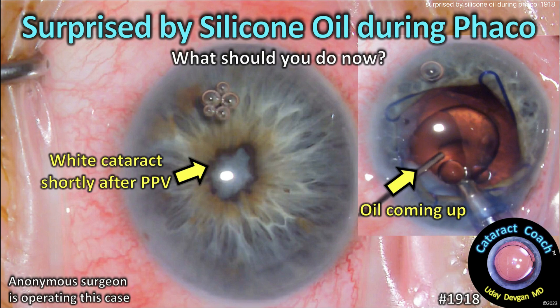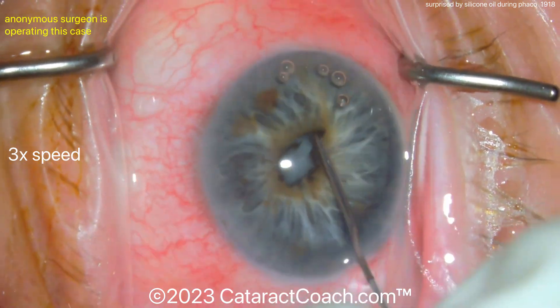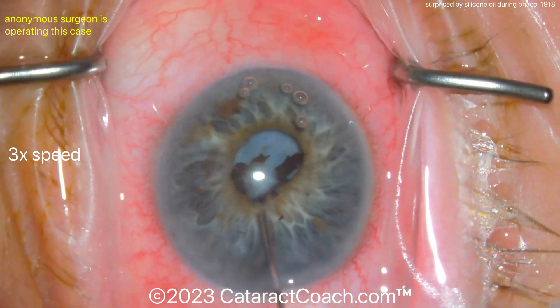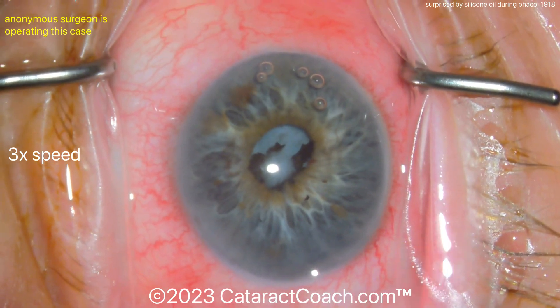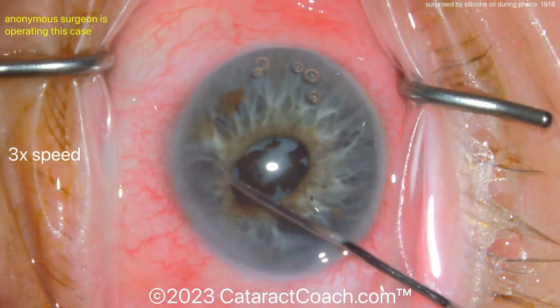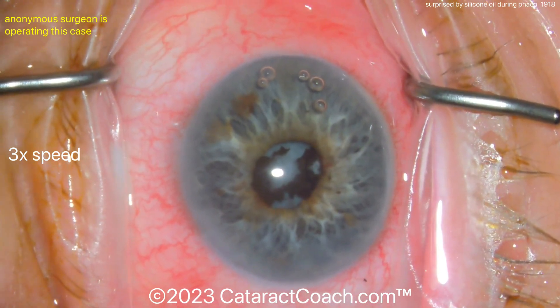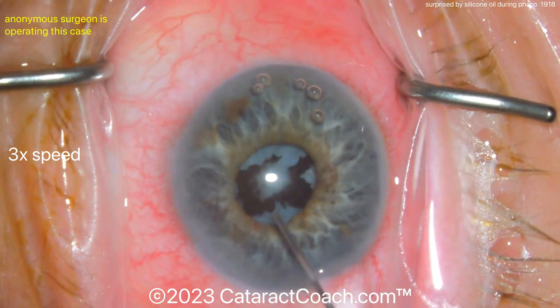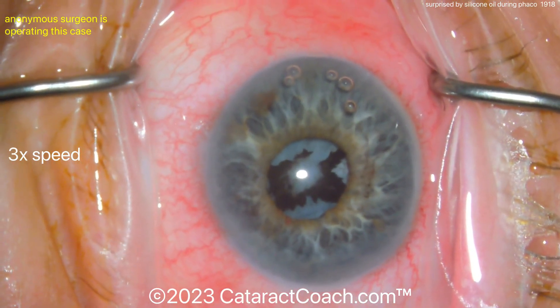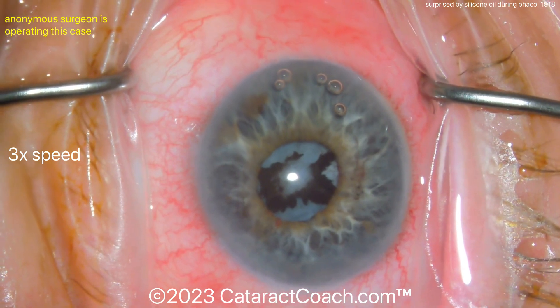The first clue is the patient got a white cataract shortly after pars plana vitrectomy. You can see breaking the capsulorhexis here, but look how deep the anterior chamber is — almost too deep. Break the capsulorhexis 360; the video is sped up here. You've got to expand that pupil, put a little more viscoelastic in, and get a pupil expansion ring or iris hooks. So all pretty routine.